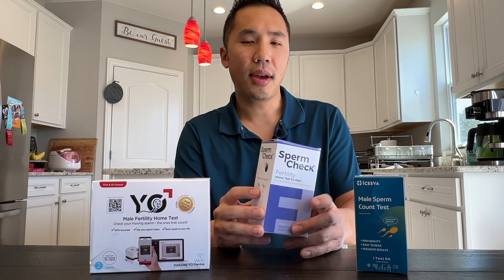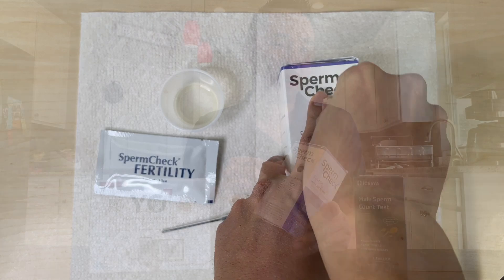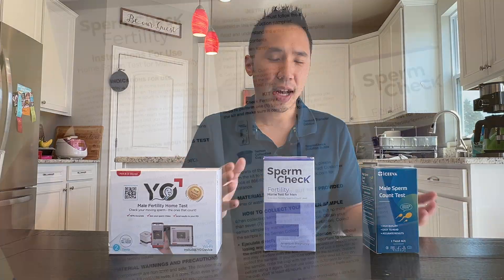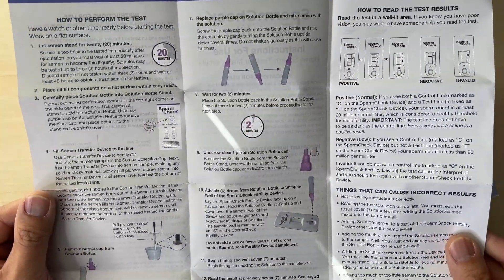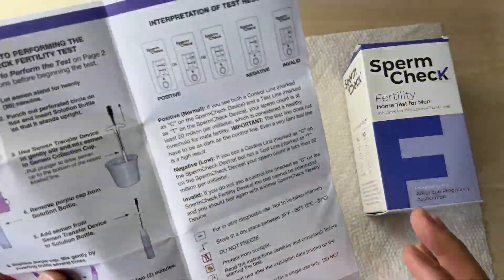I also like that there is a built-in function with the box where you can place your solution bottle so that it's stable and you don't have to worry about it tipping over as you're adding your sample. I found these instructions very easy to read. There weren't any grammatical errors or typos. It was a very large instruction pamphlet with a large font size, and the pictures were very clear. They even had a quick guide manual that you could follow if you didn't want to read all the instructions.